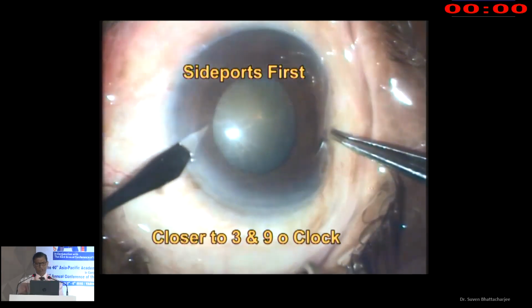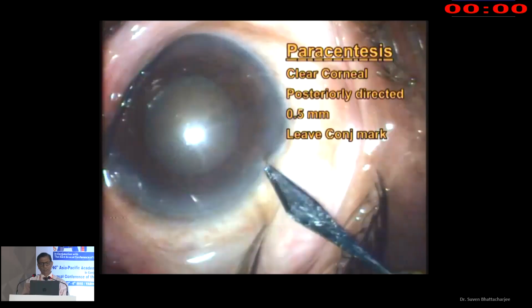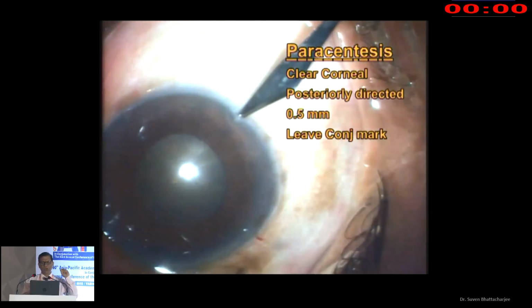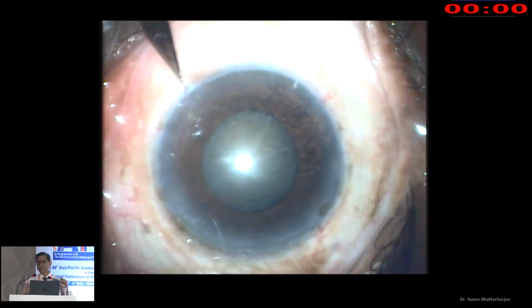Iris hooks, let's talk about them a little bit. This is a very old video. I have not been doing iris hooks for quite some time. So we need to inject viscoelastic, and we need to put small nicks on the conjunctiva. It helps identify those paracenteses that are sometimes very embarrassing.